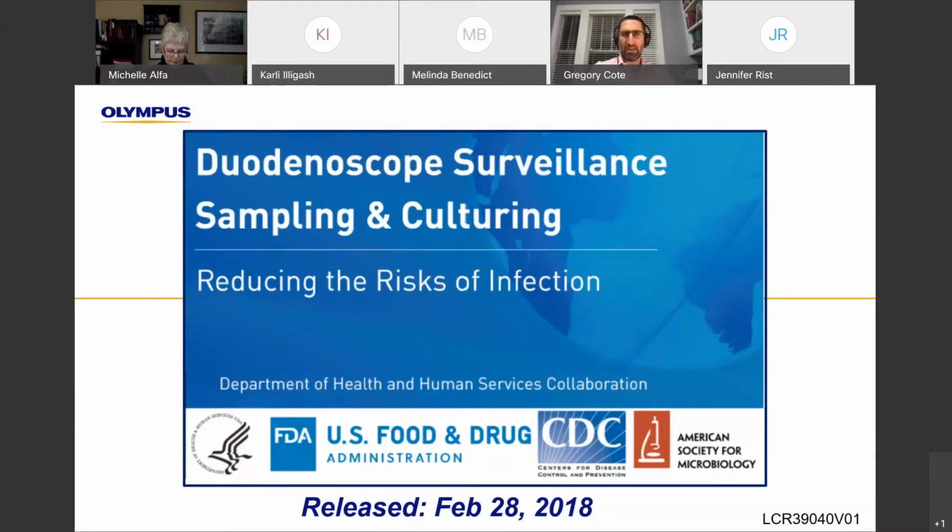And again, to get at the root of what we discussed during the first of these three webinars, the relative risk here is so exceedingly low that showing any meaningful reduction in duodenoscope or endoscope associated contamination or infection of a subsequent patient would be extremely challenging.